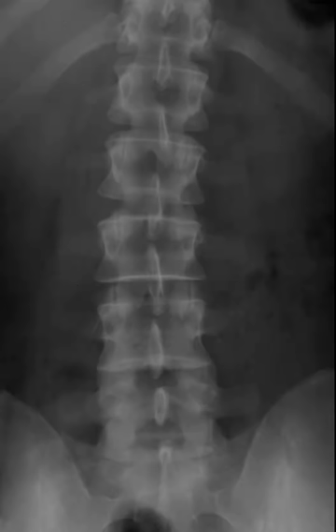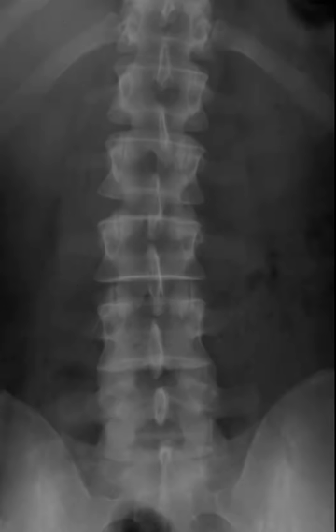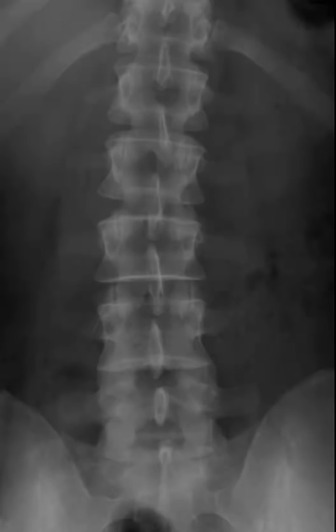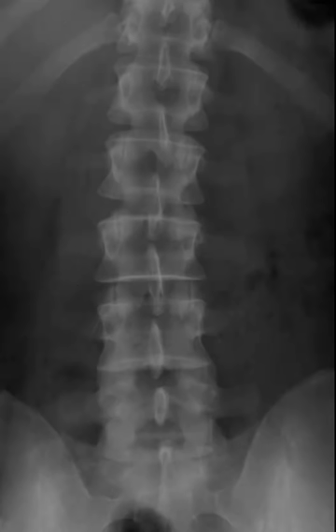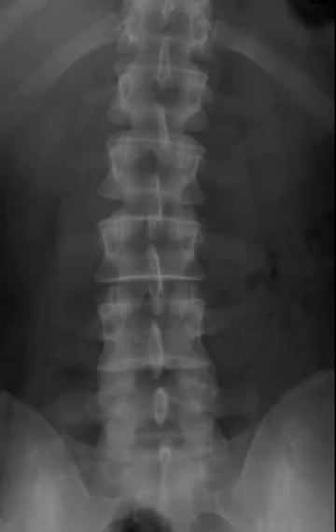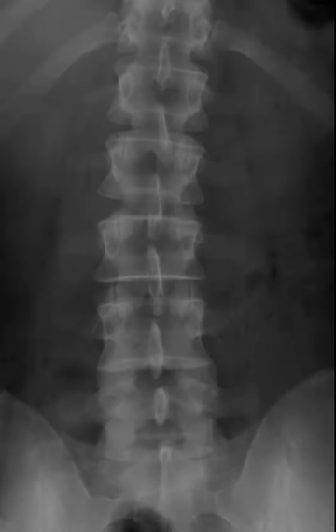The standard radiographic projections of the lumbar spine are AP lumbar, or sometimes AP lumbopelvic, combined with a lateral lumbar projection. Additional projections include lumbar obliques, which will be covered in a separate tutorial, as well as AP or PA angulated spot projections and lateral lumbosacral spot projections. These are typically used to see the lumbosacral junction very well, while lumbar obliques are used to assess the pars interarticularis and facet joints.